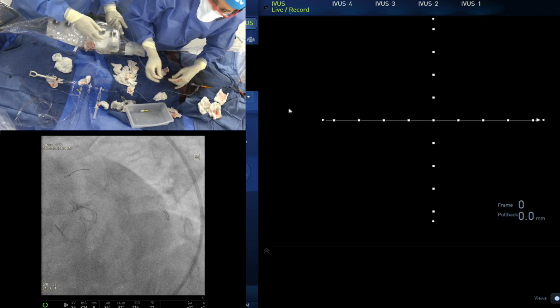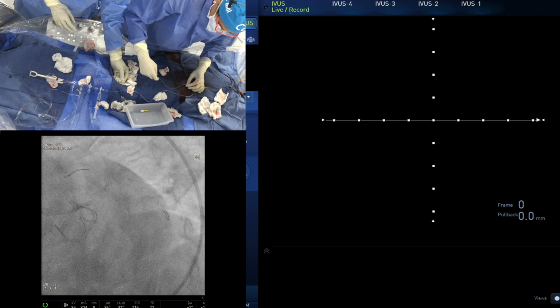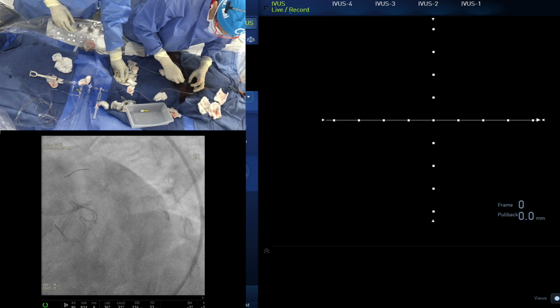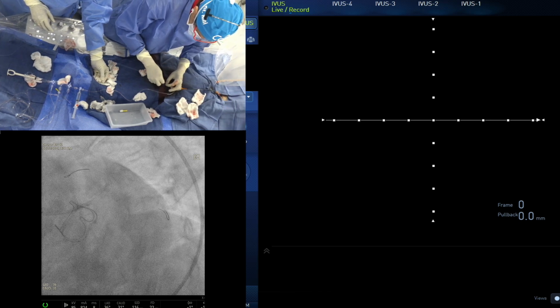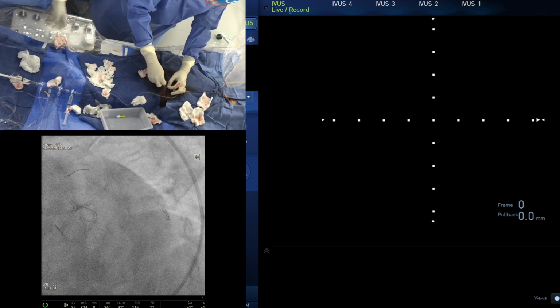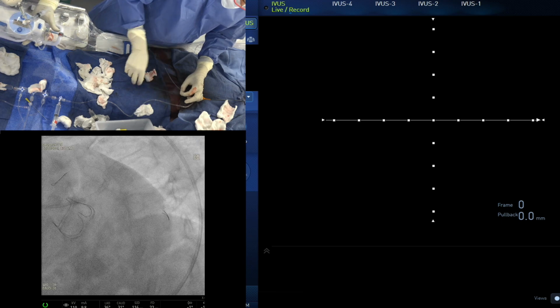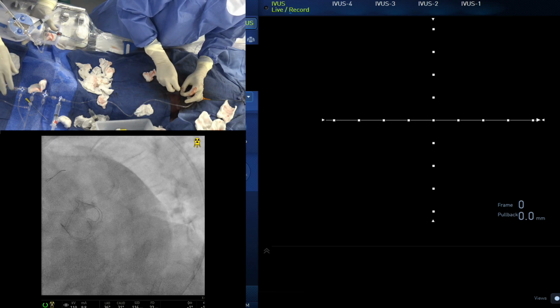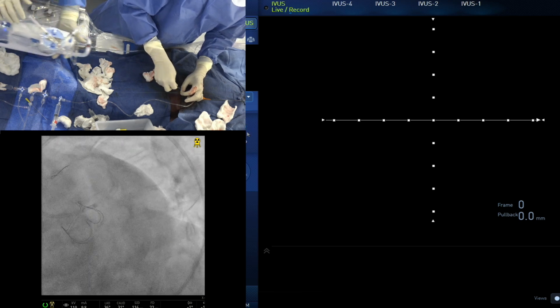It should be 11. How much, is it? 12. Yeah, 11.5. Yeah. This left main is 12. Okay, we are going into the LAD and then that's it. Done. Yep. So I think we thought that we'll come out with the one stent. We can take the circ wire out now. The one stent, but the approach was clear that with that complexity, I think you have to pay more price.